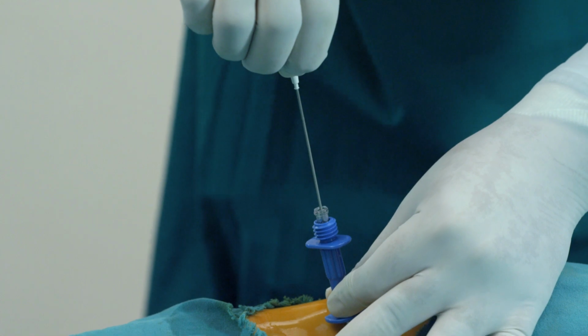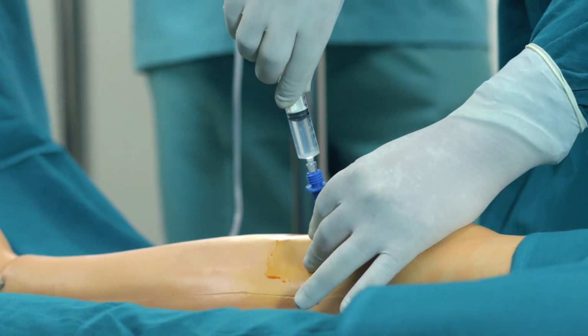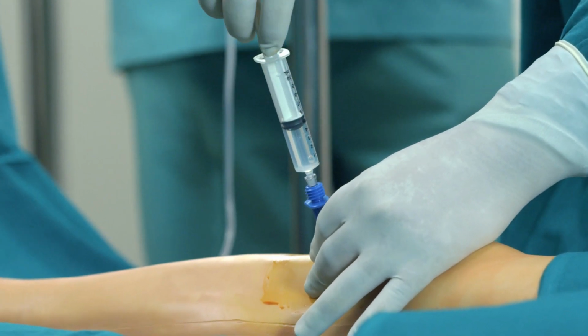This video describes the placement of an intraosseous needle in adult patients by manual insertion using the mechanical device.